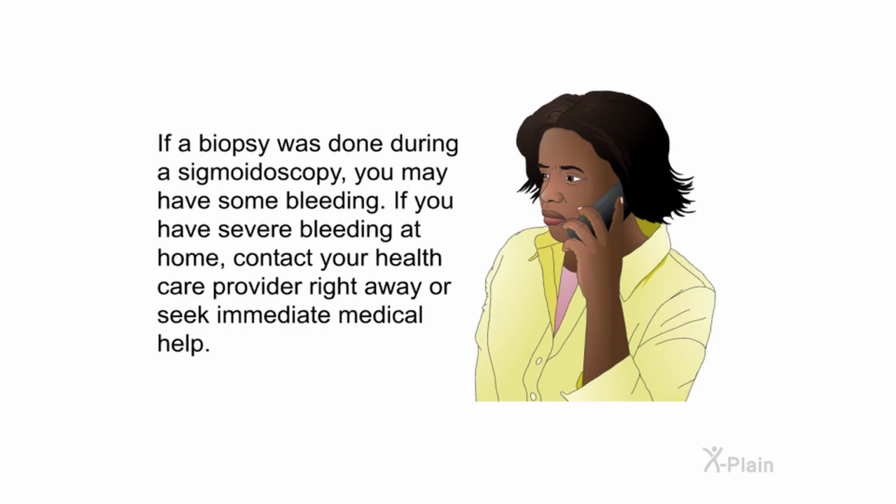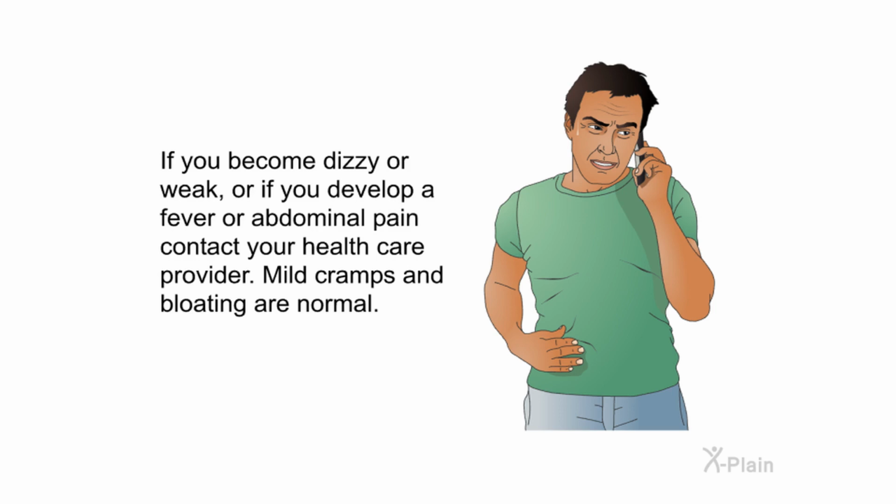After a sigmoidoscopy. If a biopsy was done during a sigmoidoscopy, you may have some bleeding. If you have severe bleeding at home, contact your healthcare provider right away or seek immediate medical help. If you become dizzy or weak, or if you develop a fever or abdominal pain, contact your healthcare provider. Mild cramps and bloating are normal.